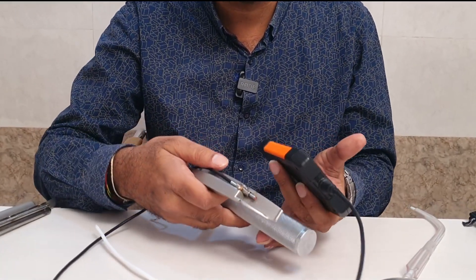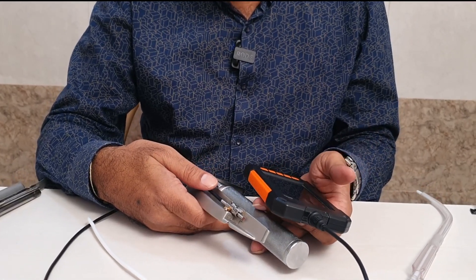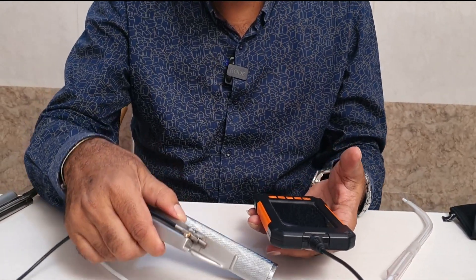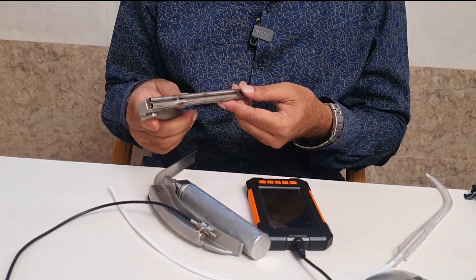Then I bought a borescope imported from the US — I will send the link, it is also available on Indian Amazon. It has a built-in screen along with the scope, and it is just a 3.5mm scope.